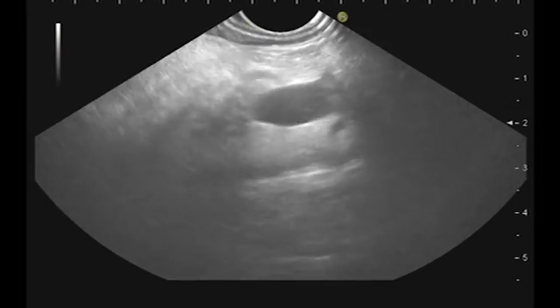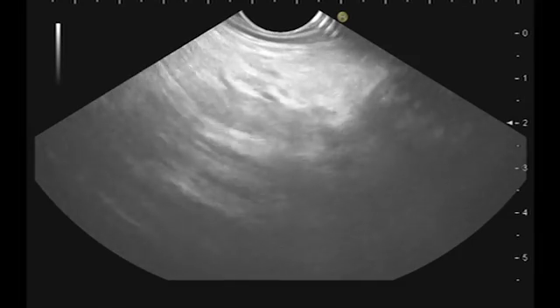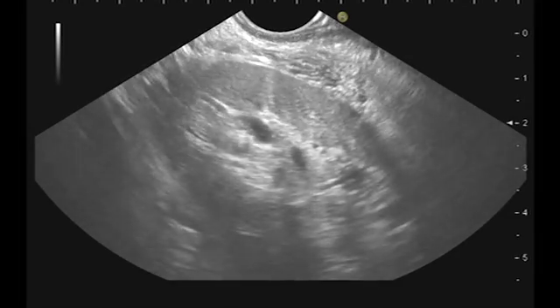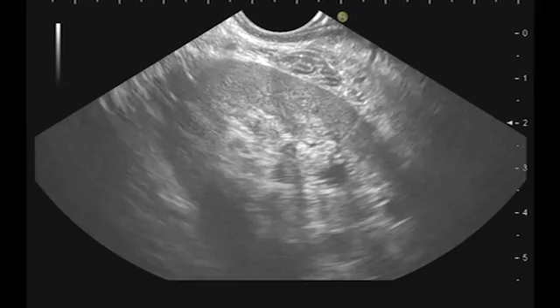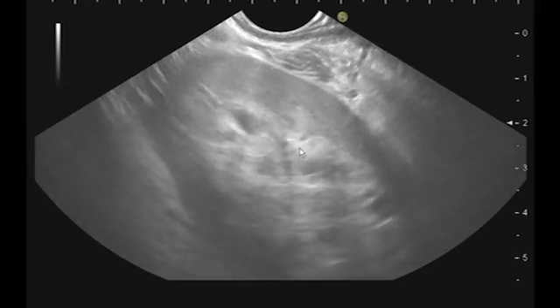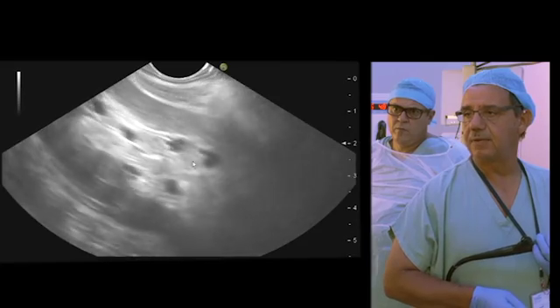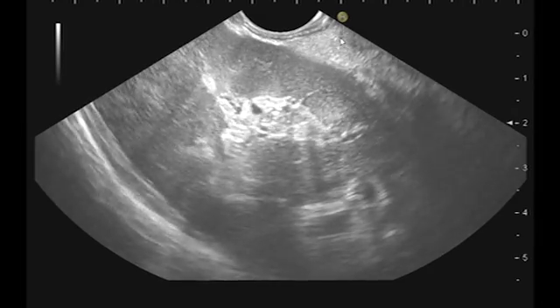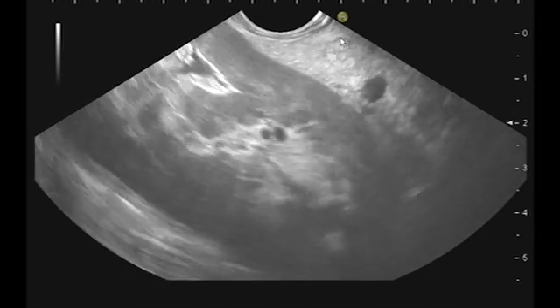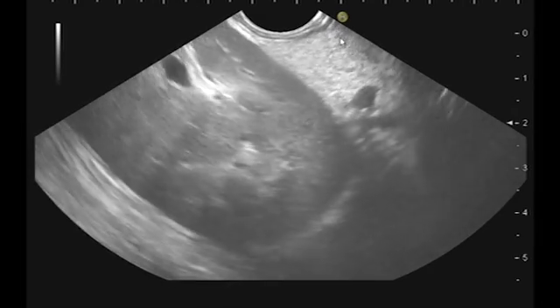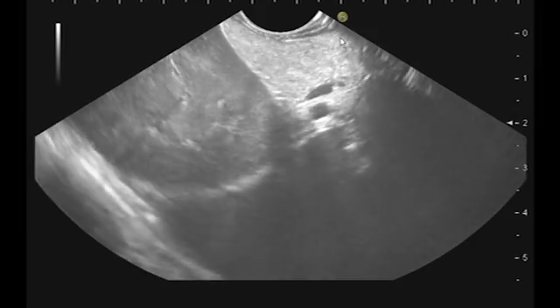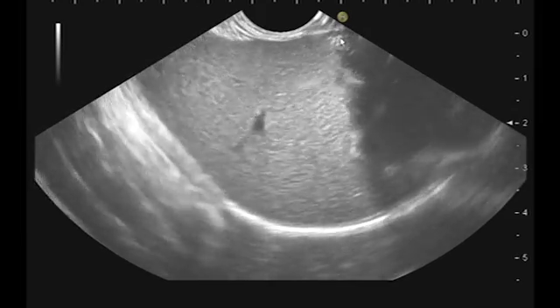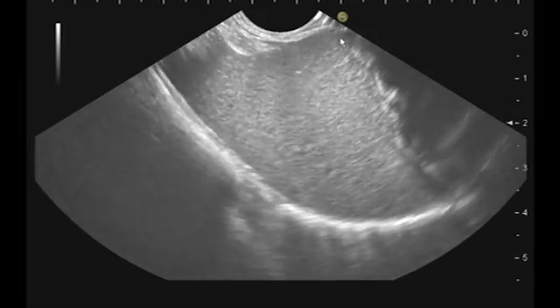Now, if I do a clockwise rotation, I will see the left kidney. This is the left kidney here. And if I pull back my scope, I will find the tail of the pancreas here, and after the spleen. This is the spleen. The spleen here is normal. There is no dilatation, no portal hypertension.